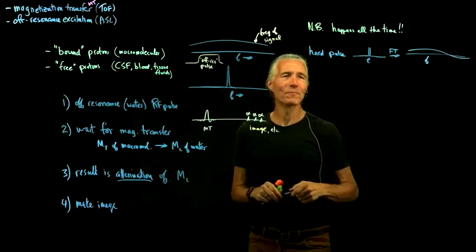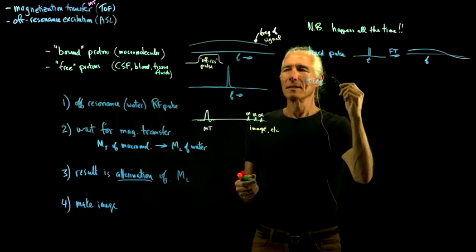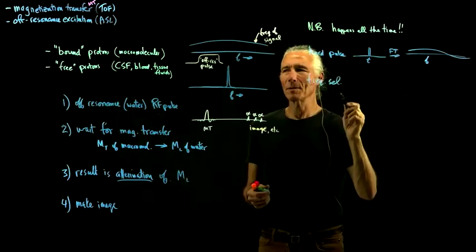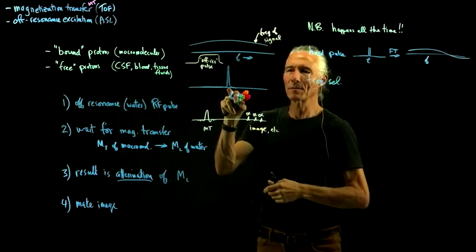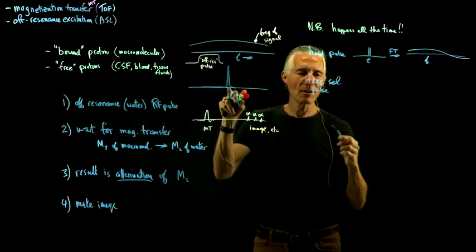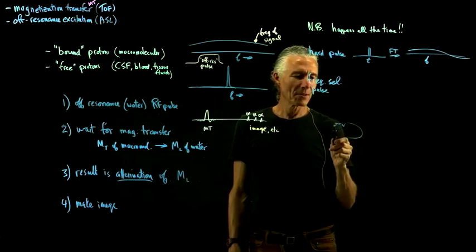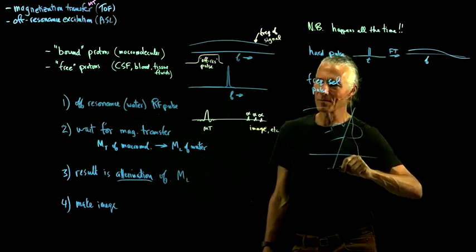But what about a frequency selective pulse? Even a frequency selective pulse will cause this. You'd figure okay, so we don't do a hard pulse because that's a sloppy one and it hits all these different frequencies. Let's just do a pulse that has a frequency range that looks more like what we're trying to excite. So if you do a frequency selective pulse, what is the thing you do? Well, you've got the person in there, and you turn on a gradient. And what does the gradient do? Say it was the Y gradient, it changes the resonant frequency.